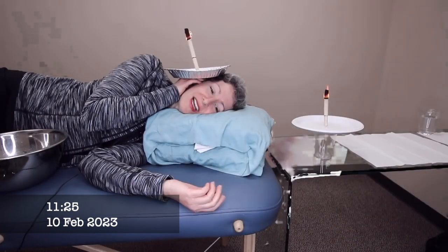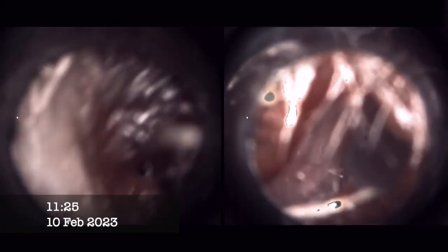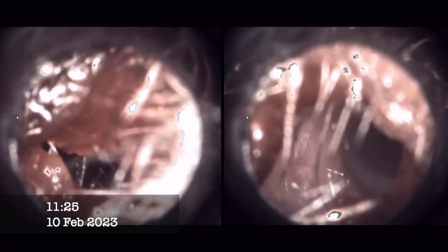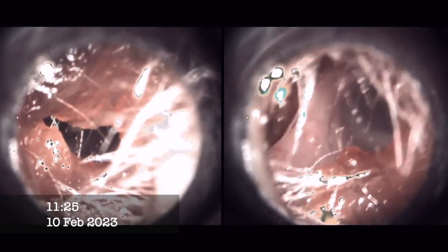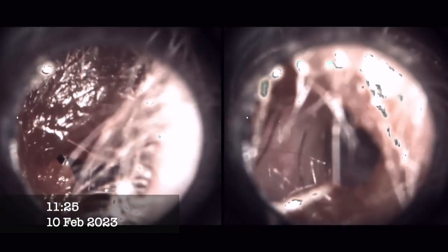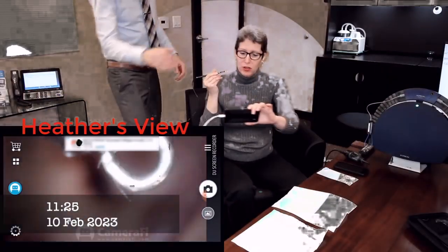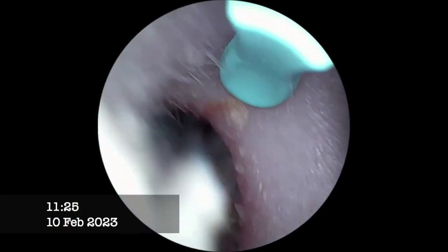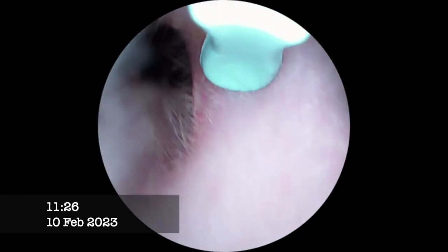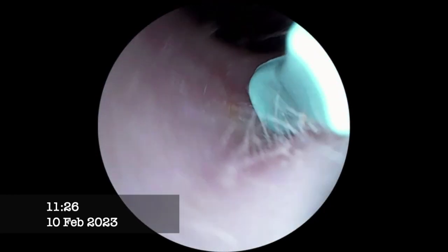Of course, I invited back retired nurse practitioner Heather Wen, who you may recognize from my ear candling video. Heather always has a healthy amount of earwax for us to remove about every 3 months. You can see here that she has built up a substantial amount of earwax both in her left ear and her right ear since the last time I removed it for her. And since Heather is a retired nurse practitioner who is very familiar with the anatomy of the ear canal, if anyone has a shot at visualizing their own ear canal and removing their own earwax, it would be her.